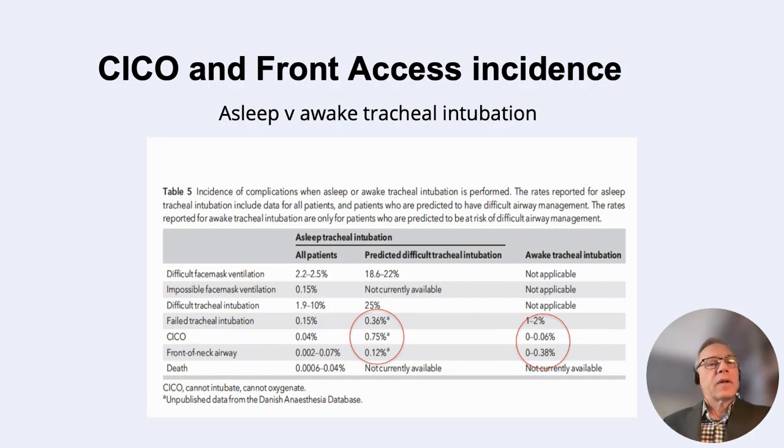Now, this is interesting data from a Danish database comparing asleep versus awake tracheal intubation in terms of scenarios leading to can't intubate, can't oxygenate, and incidence of the front of the neck access. So they compared patients with a predicted difficult intubation using asleep and awake intubation.